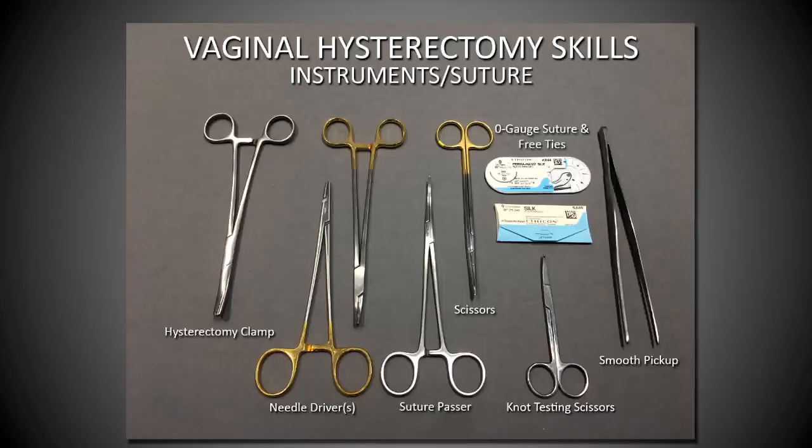The instruments and suture needed for task performance are illustrated here.